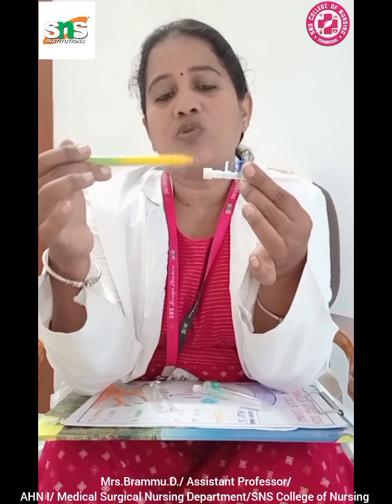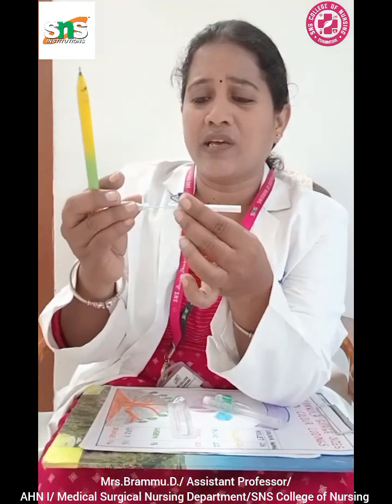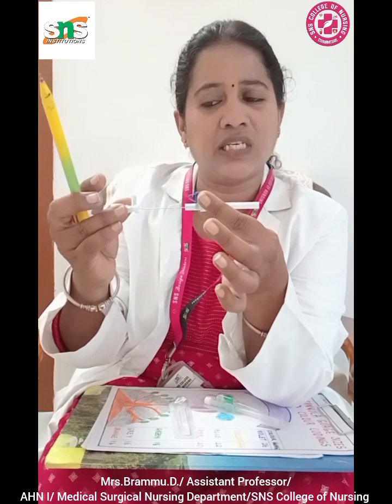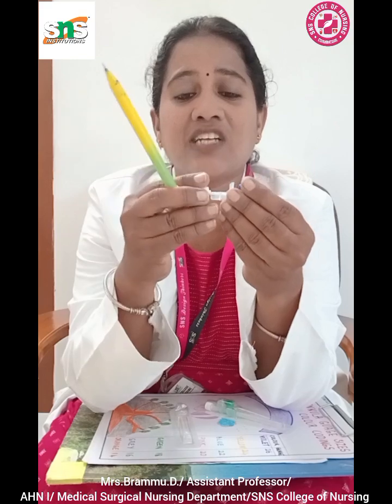Now we are going to see the luer lock plug, which is the white one that you can see on the outside. I would like to come closer to the camera. This white part we call the luer lock plug. You may ask why it is essential. When you open the IV cannula, you have the cannula as well as the needle. This adapter, the luer lock plug, is very essential because it connects the IV cannula and the infusion system.